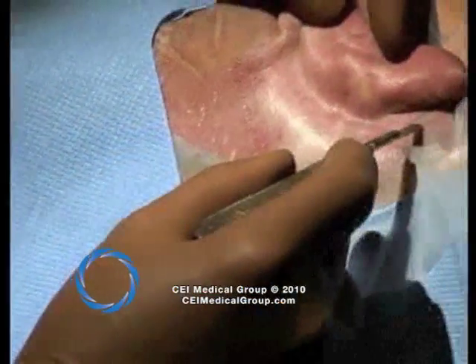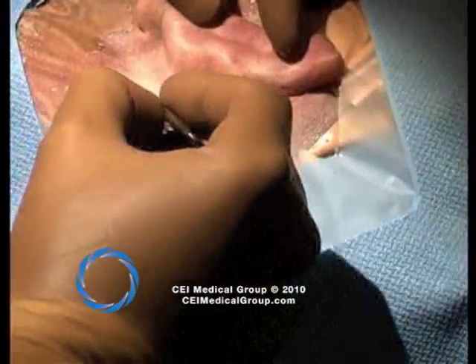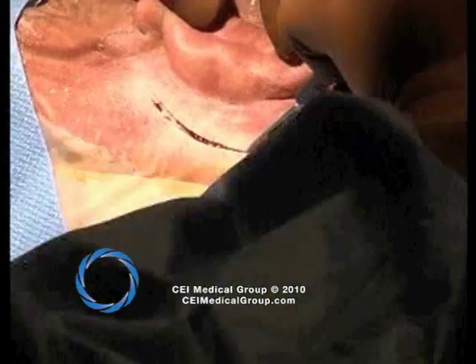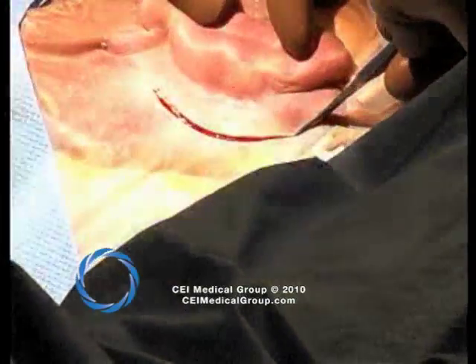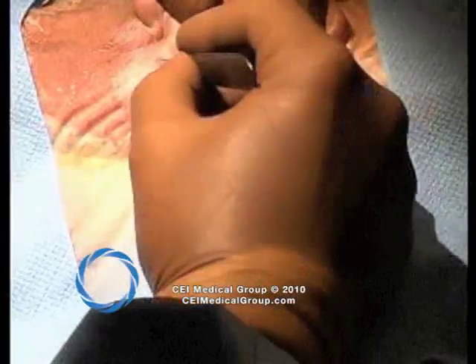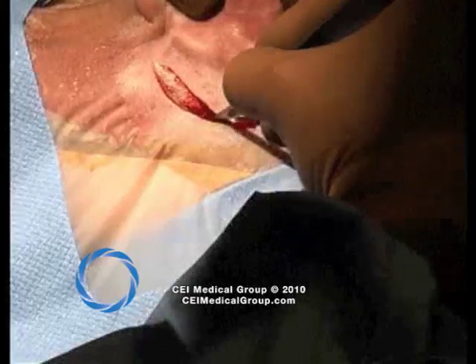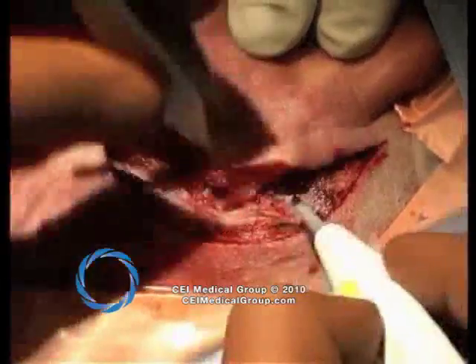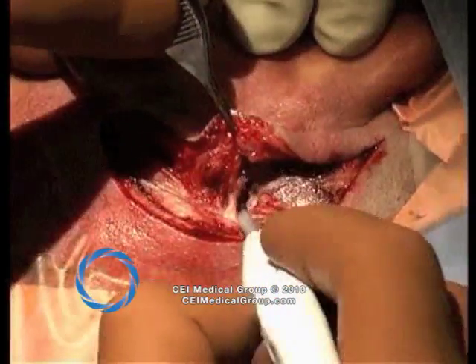Here, the previous incision is demonstrated with a 15 blade, and a secondary incision is made more posteriorly in order to allow exposure of the cortex and temporal parietal bone for harvest. A large amount of fascia is needed for this procedure, and this larger and more superior incision allows harvesting of fascia in a much easier way.